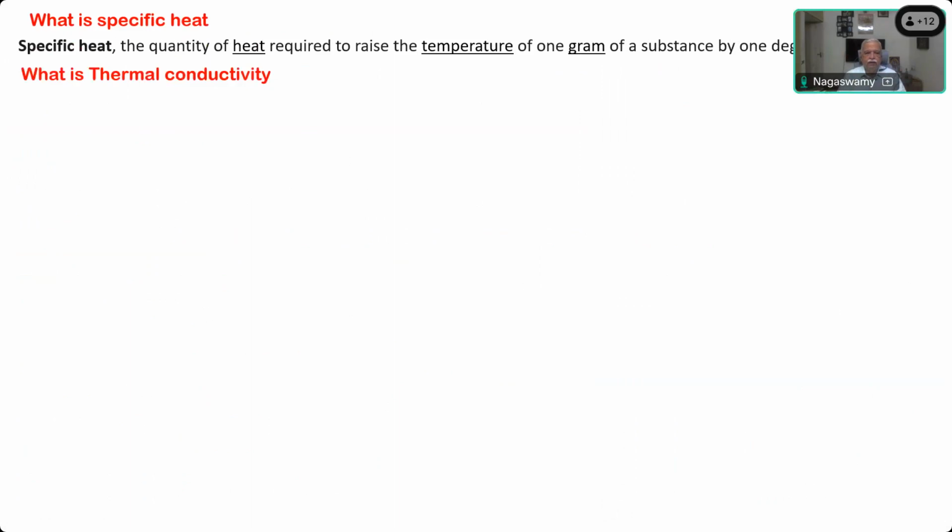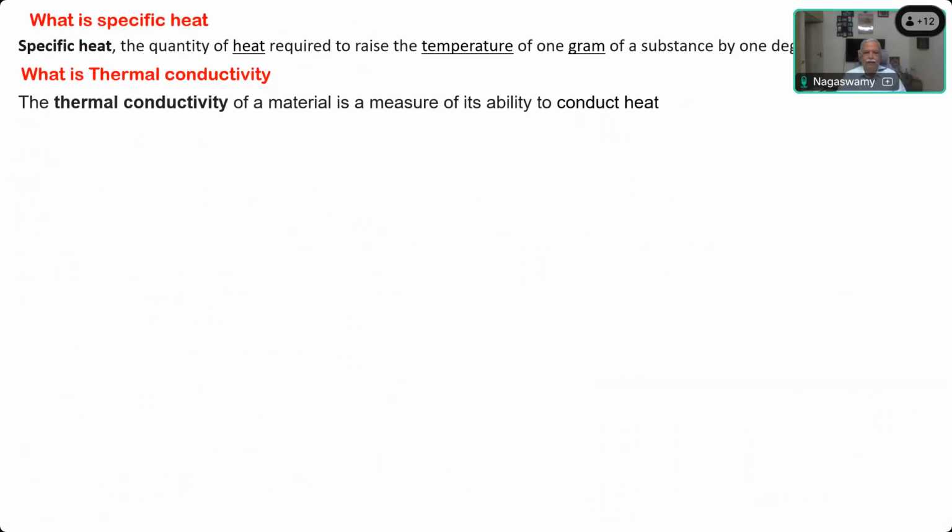Okay. And what is thermal conductivity? To which particular thing does it apply? Does it apply to the volatile liquid or the material to make the container? It applies to materials, sir. It is again applied to the material. So it is a material measure of the ability to conduct heat. Whatever material out of which we are making our vaporizer, it should be able to take the heat from the surrounding atmosphere and then supply it to the liquid inside. So it should have an ability to conduct that heat. That is called the thermal conductivity, and it should be able to get heat quite faster.